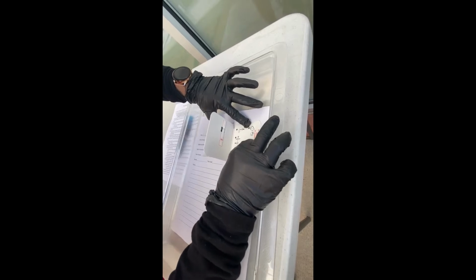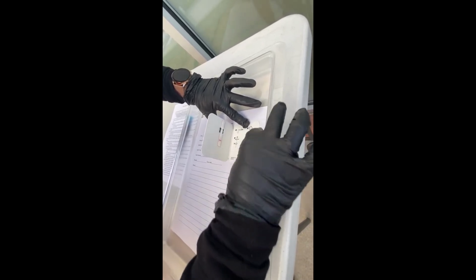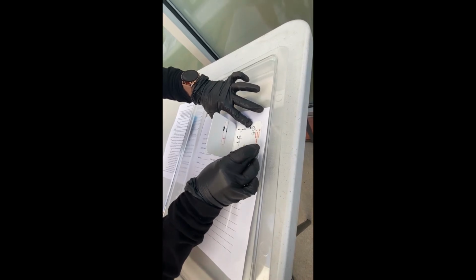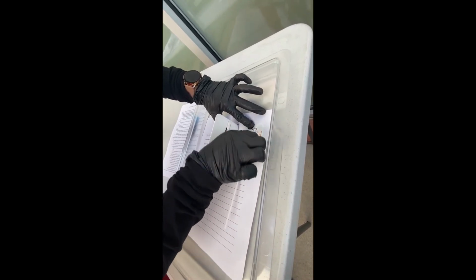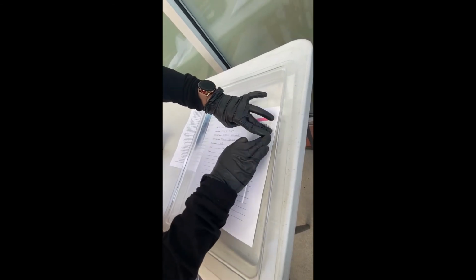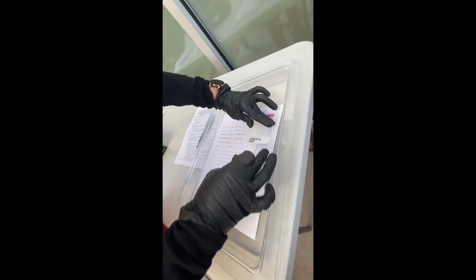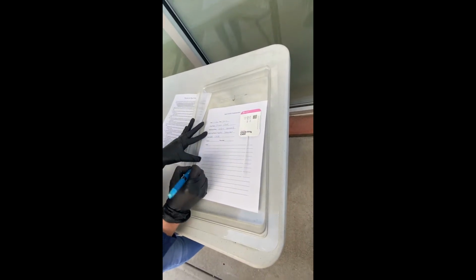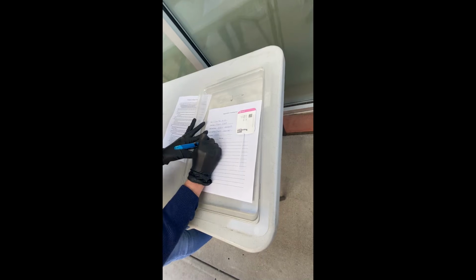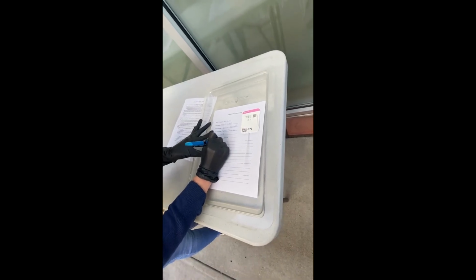Leave the swab in the card for the remainder of the test and peel off the adhesive liner. Close the test. And the tech will now note the time of the completion of the test. The test can be read exactly 15 minutes.